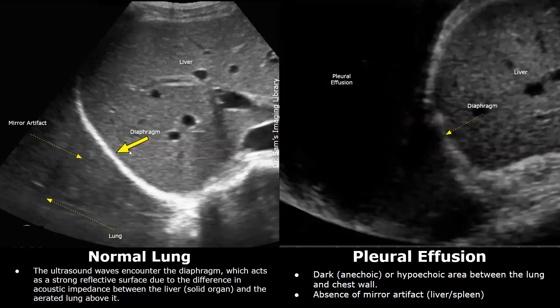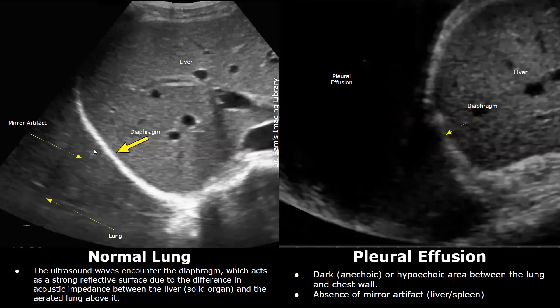This is the liver. This bright hyperechoic line is the diaphragm. This is the air-filled lung — we see mixed echoes above the diaphragm. We actually see a mirror artifact: a mirror image of the liver is seen above the diaphragm. It is more pronounced on the right side; on the left side it is not as clearly seen because of the spleen — the spleen's mirror artifact is less clear compared to the liver.